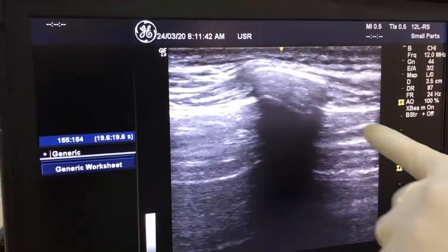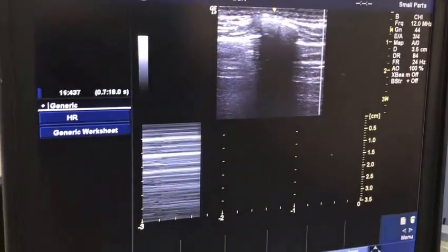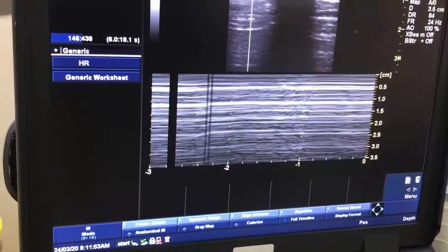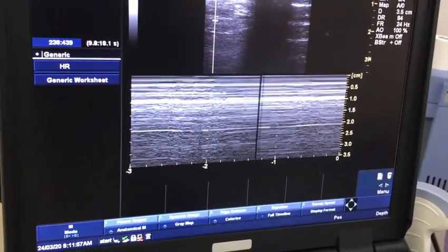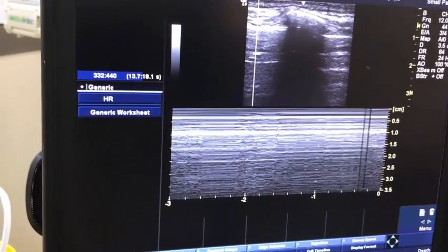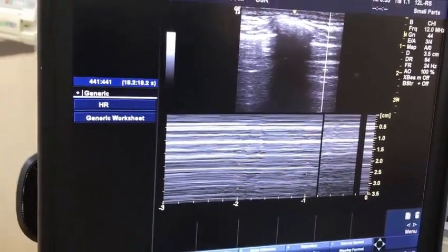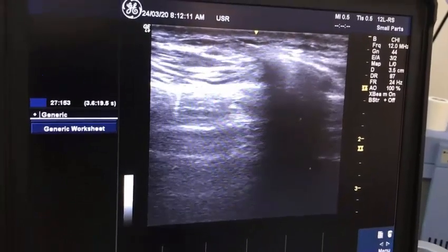In M-mode — concentrate please — this is loss of the seashore sign. And if I move here, there is the seashore sign. Okay, and this is loss of the seashore sign — you can see this very clearly here again.